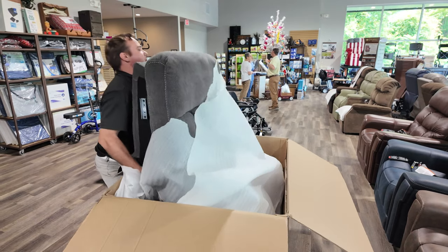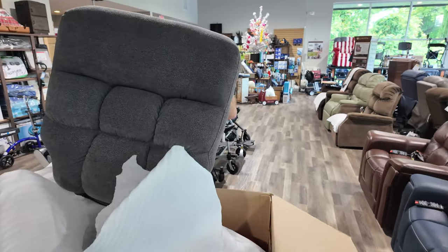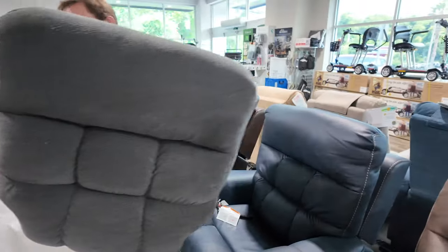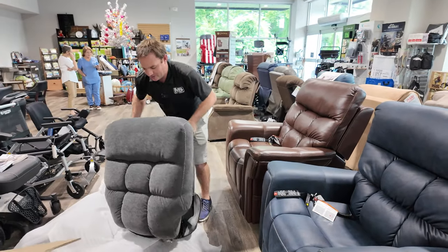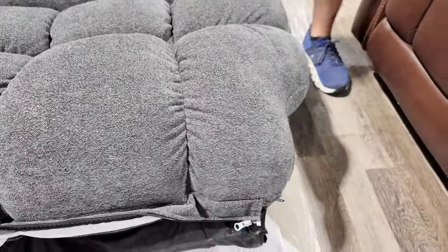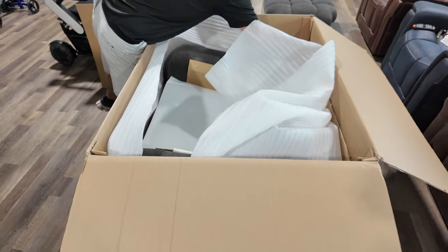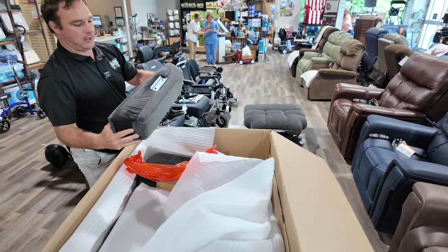It's got the lumbar adjustment — this is really pretty. This also has the power pillow, that's why it's heavy. Now you can do this a couple of ways: you can go back in here and grab these — these are for the sides of the back.